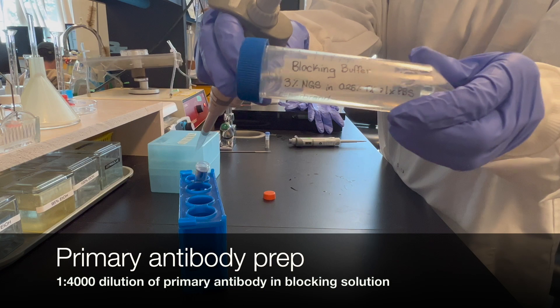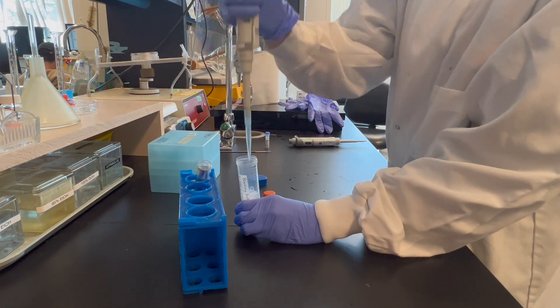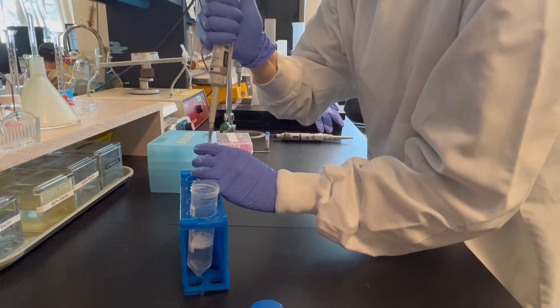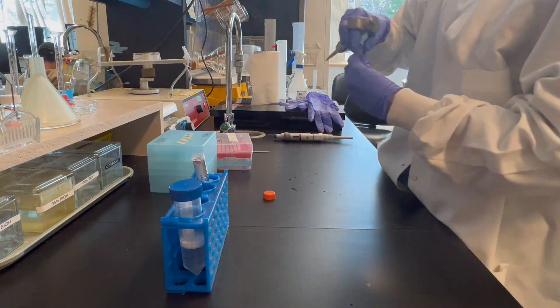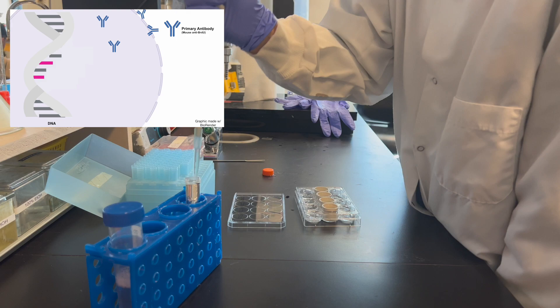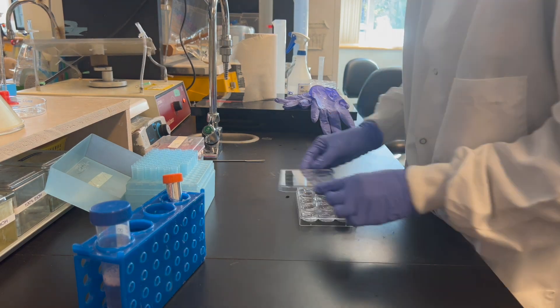After this step, prepare your primary antibody solution by making a 1 in 4000 dilution of the primary antibody in the blocking solution. Pipette about 2 milliliters of the 1 in 4000 primary solution into each well. Transfer the slices into primary and leave shaking in a fridge at 4 degrees Celsius for 16 hours.